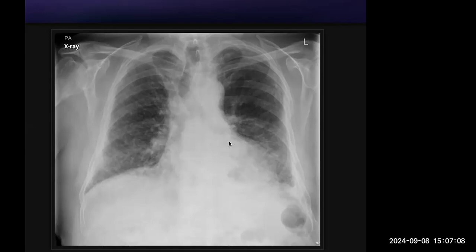I would be suspicious for it if the patient had any history of fever. This would represent some infection, like a bacterial or a tubercular infection. But if the patient had no such history, it could be neoplastic, or it could represent some vasculitic type pathology if the patient had such history prior, and I would further investigate for it.